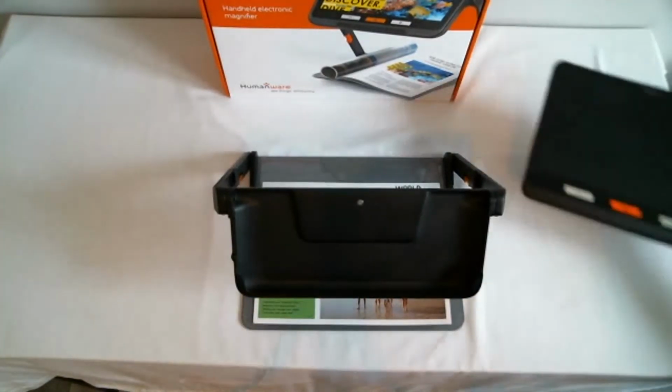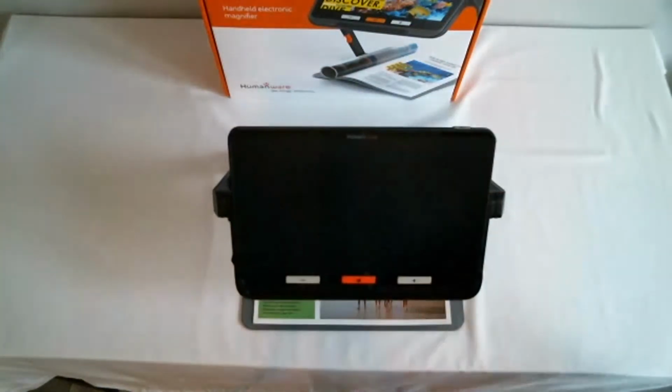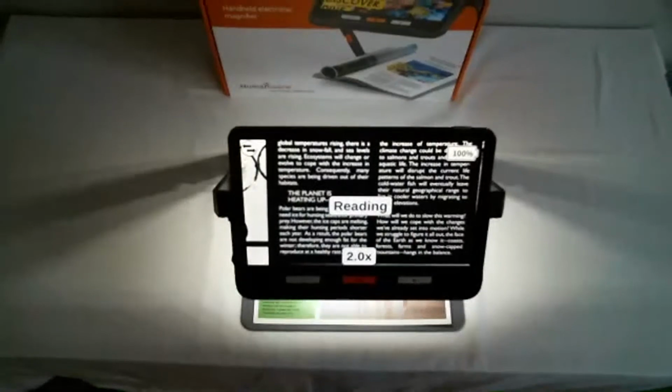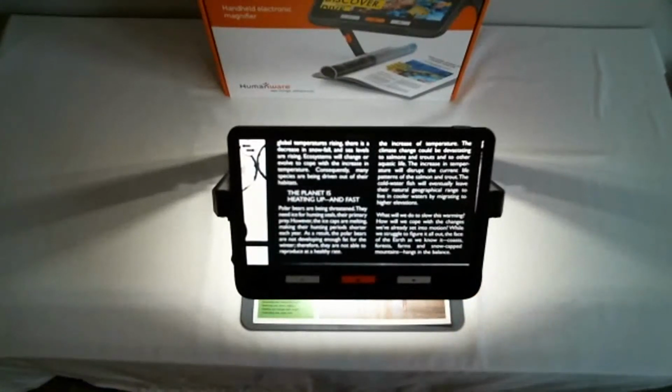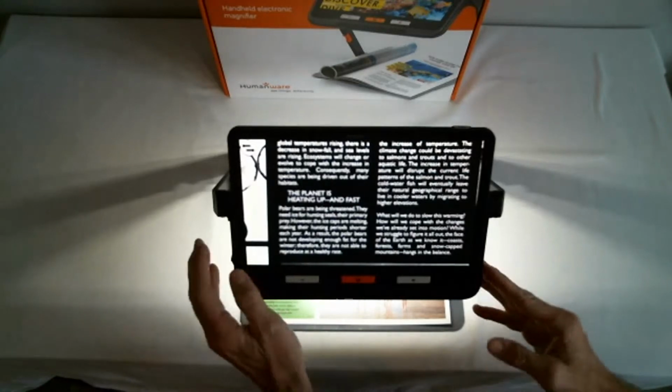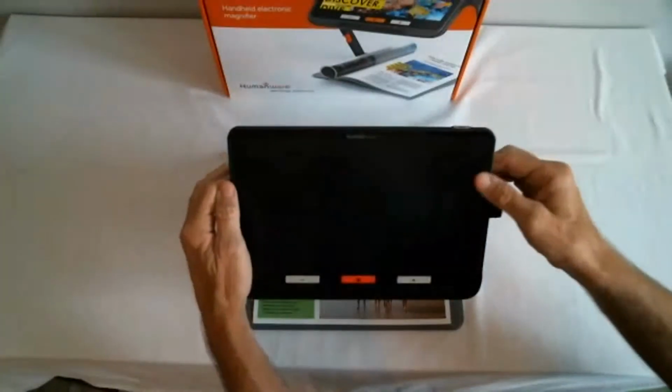But I can grab my explorē 12 now and set that into the device tray, and it will automatically turn on. And as you can see here, I have my device set up to be in a white text on a black background mode. So it does automatically turn on when it's placed into the stand. I can come up to the upper left of my explorē 12 and power it off.